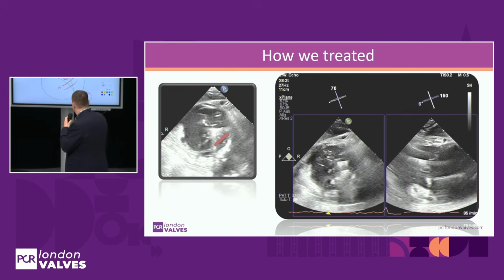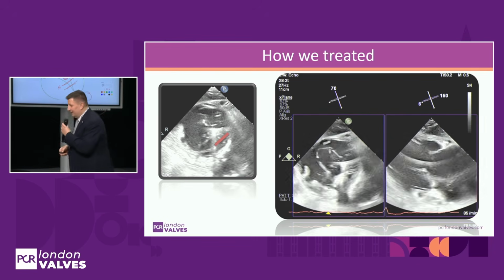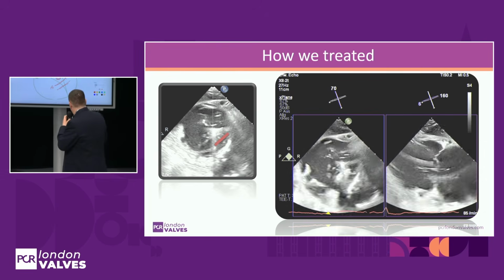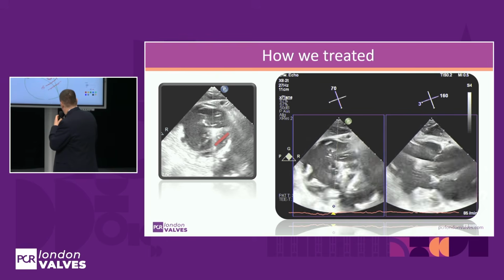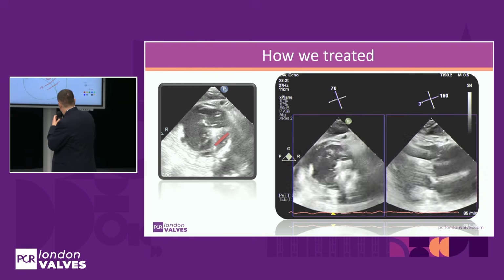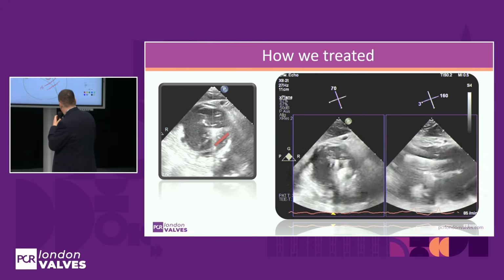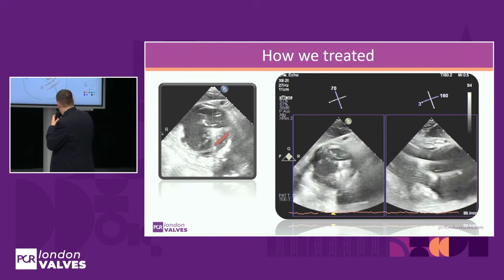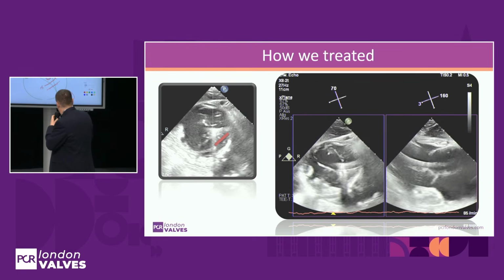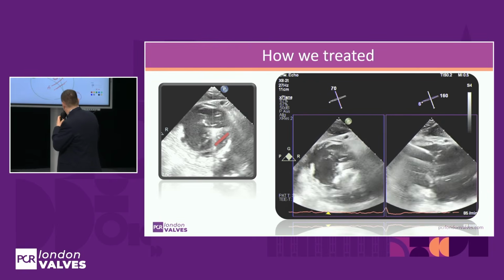And the thing is, we have a little problem here because we have a shadowing of the leaflet. So Francesco mentioned that if you go from posterior to anterior, then you have a shadowing. But now you see here the grasp loop, and it works. So the anterior leaflet is still on the clip arm, and also the septal leaflet is coming on the clip arm. And we can see it here. And this was the grasp.